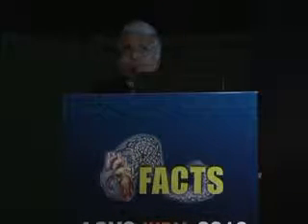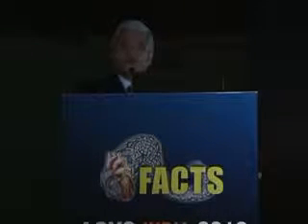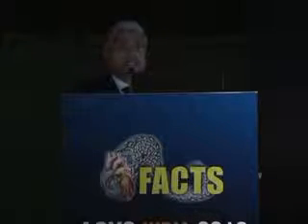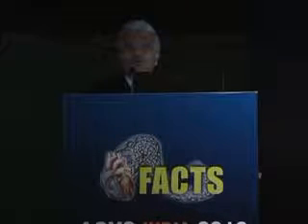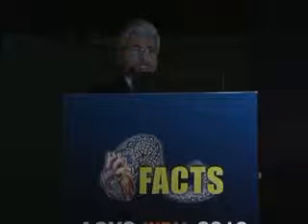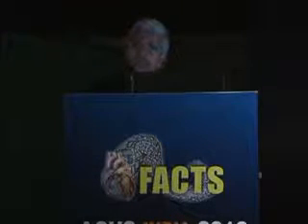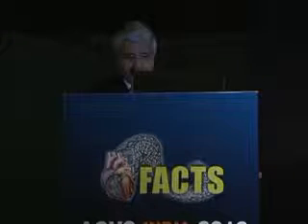I'll dwell on this point later too, but generally speaking, too small a child, too small for the hardwares that we are likely to use, an extremely tortuous, non-navigable fistula, multiple drainage sites, or there is an uncomfortably close major branch which you don't seem to be able to exclude, or if you can't reach distal enough into the fistula. These are some of the reasons why we may decide not to do a catheter closure and straight away recommend surgery.